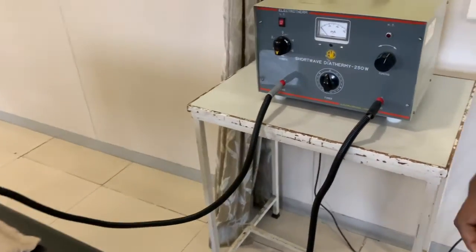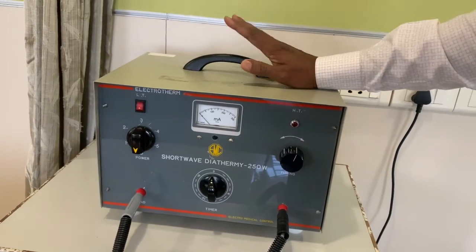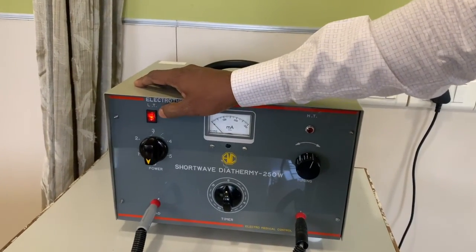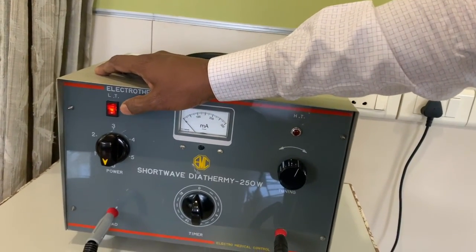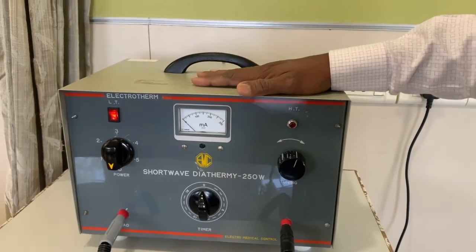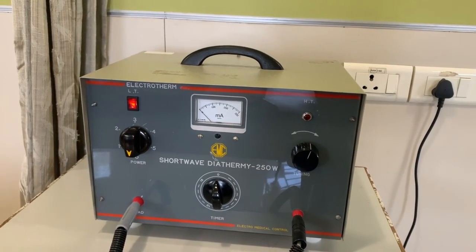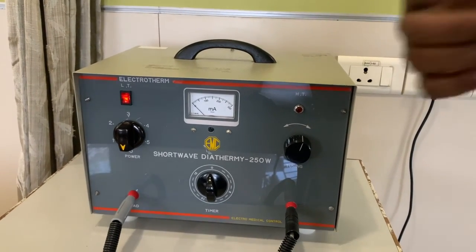So next is testing the machine. But the first step is to switch on. As you switch on, this is the rocker switch which has an LED indicator. You can see the glow of the indicator. That means the machine has switched on. Generally we wait for 2 to 3 minutes so that the machine gets sufficiently warm. The thermionic valve gets heated up and it is ready for the emission of the high frequency current.